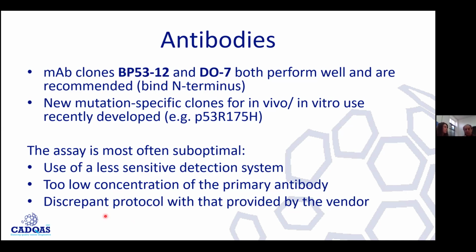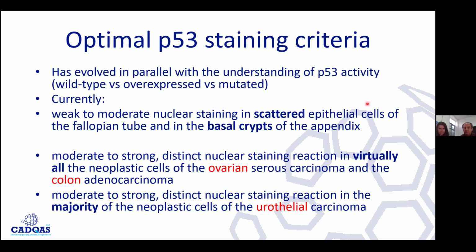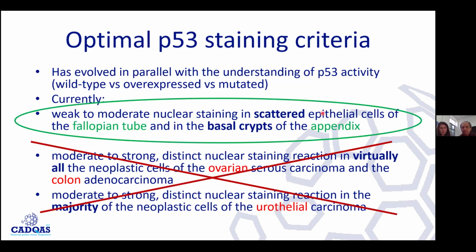But then the same antibody stains another tissue, so it's not the same protein. So there was a lot of confusion over these matters in the early days. This is just to say that it's mostly suboptimal, and again, we already discussed this, use a normal bit of tissue that is adequately fixed.